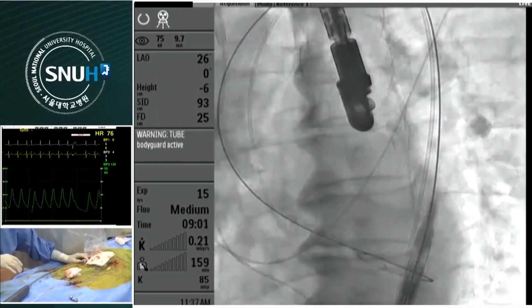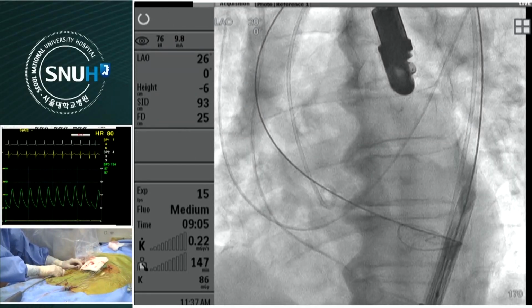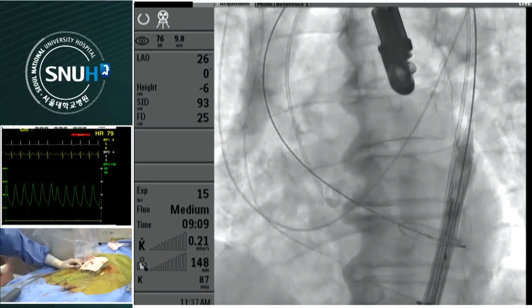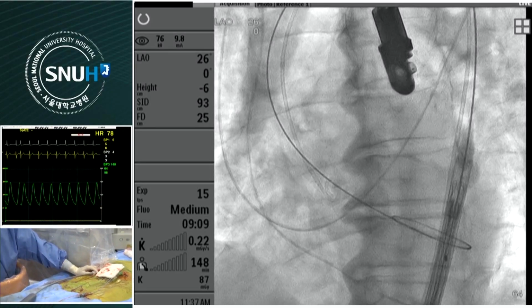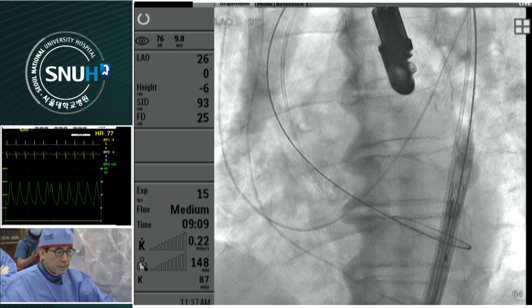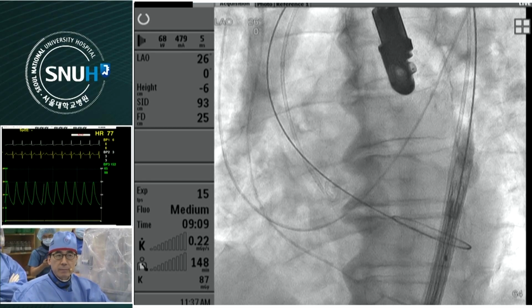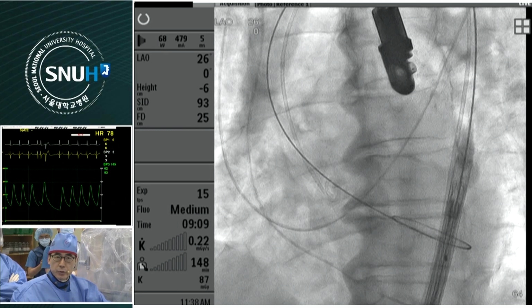The height of the left coronary ostium is only 10 millimeters. So is it enough for the LOTUS valve? That is a kind of concern. Good comment. Would you protect the left main? This is a retrievable system. When there is obstruction of left coronary flow, then we have to recapture the system, put in a coronary guiding catheter and then deploy the valve. And if necessary, we have to do left main stenting.